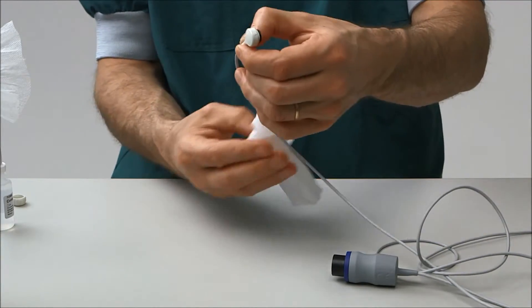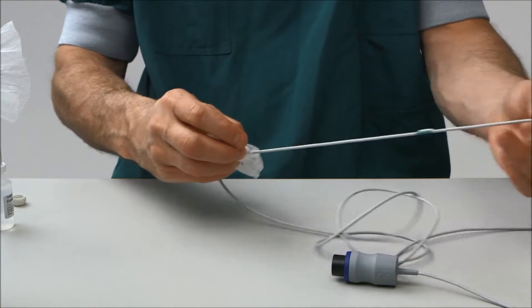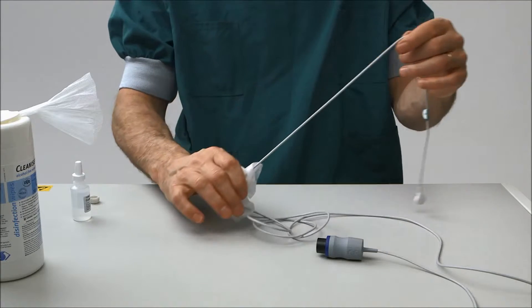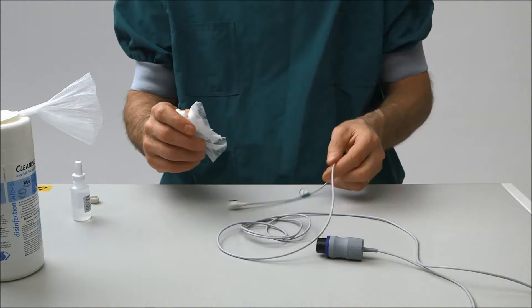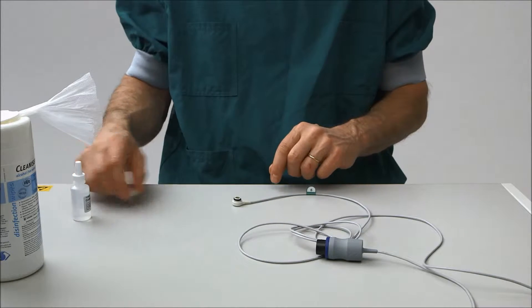Avoid exposing the electrode cable to any product based on isopropanol, propyl alcohol, or alcohol, as prolonged exposure to these products may damage the electrode cable. Please refer to the manual for complete instructions on cleaning and maintenance.